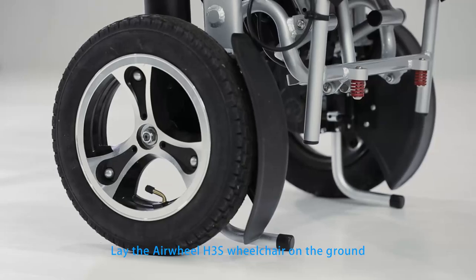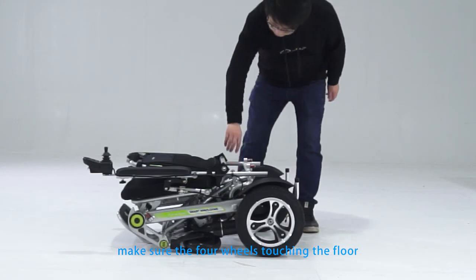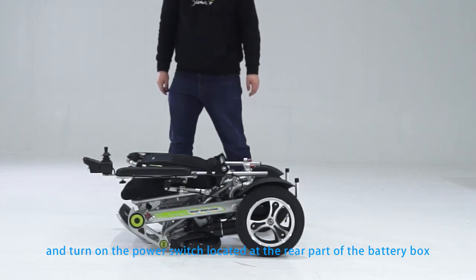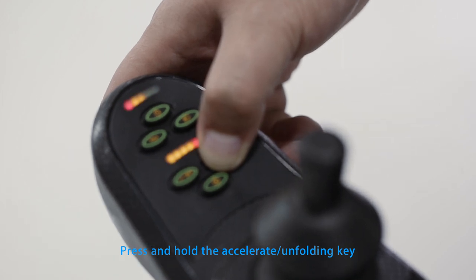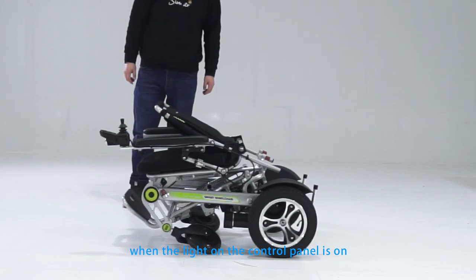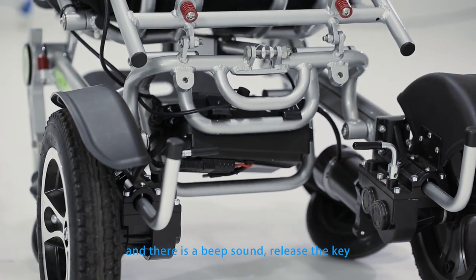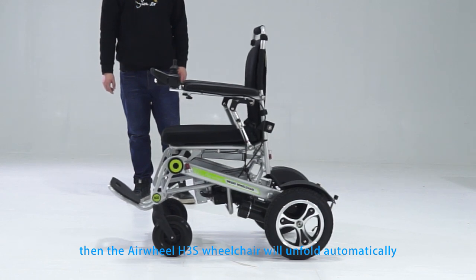Lay the Airwheel H3S wheelchair on the ground, make sure the four wheels touch the floor, and turn on the power switch located at the rear part of the battery box. Press and hold the accelerate and unfolding key on the control panel for three seconds. When the light on the control panel is on and there's a beep sound, release the key, then the Airwheel H3S wheelchair will unfold automatically.